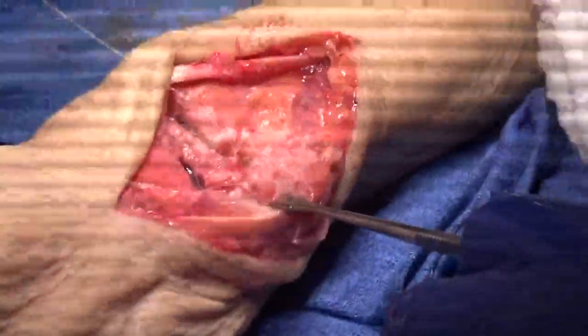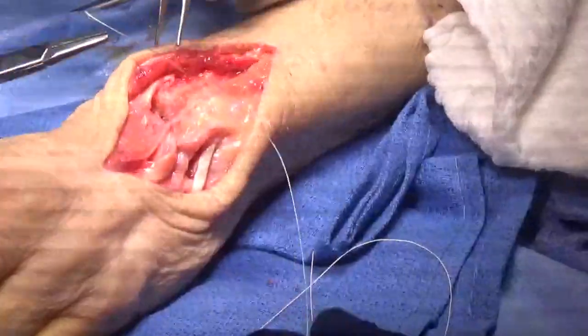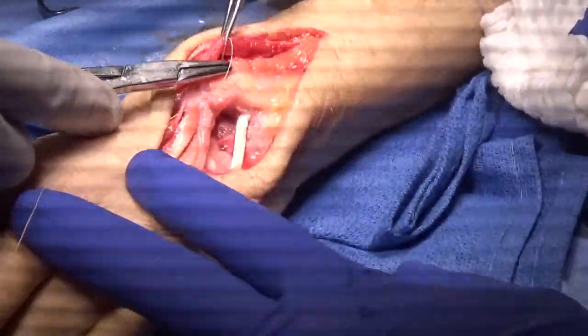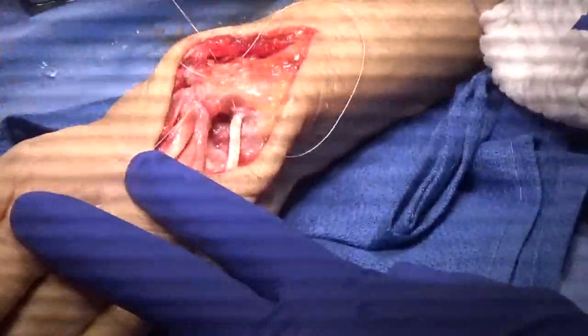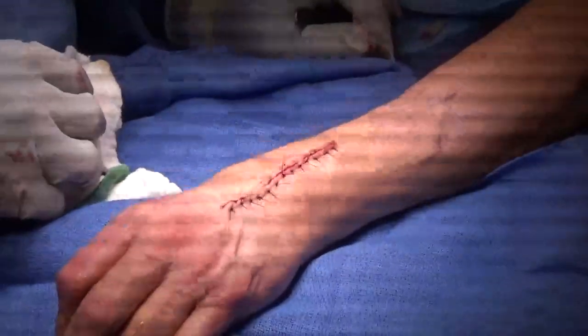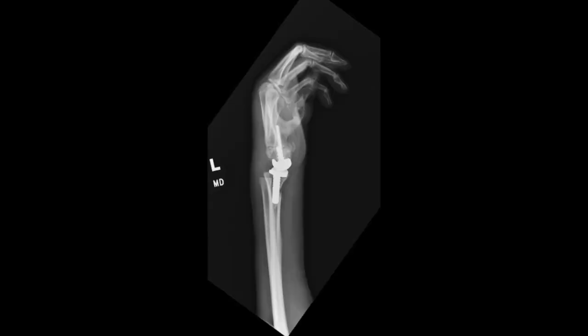Only the ulnar aspect of the dorsal capsule is closed to help maintain as much wrist flexion as possible. And then the second and fourth dorsal compartments are closed, again leaving the extensor pollicis longus free. Post-op radiographs show excellent position of the prosthesis in both the AP and lateral planes.